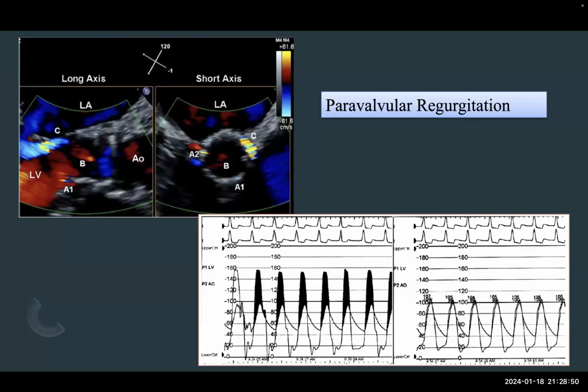No. But I do it for everyone if there is approval and if it is safe, because sometimes patients have different aortic arch anatomy that makes it very difficult to put these baskets, so when you do it you might cause a problem. There is a controversy.